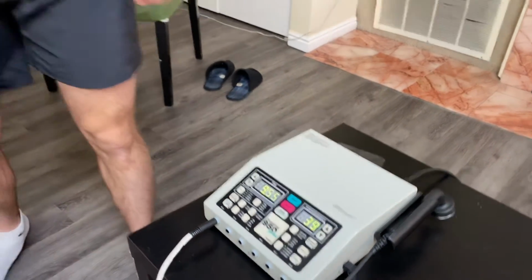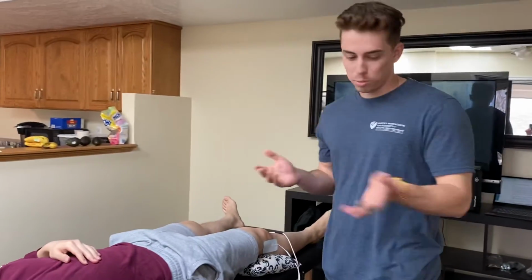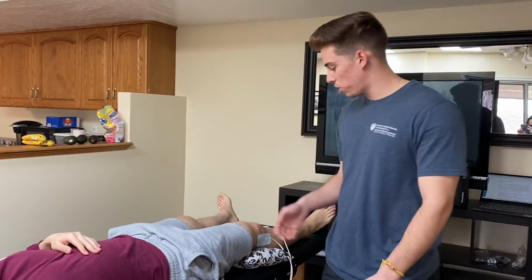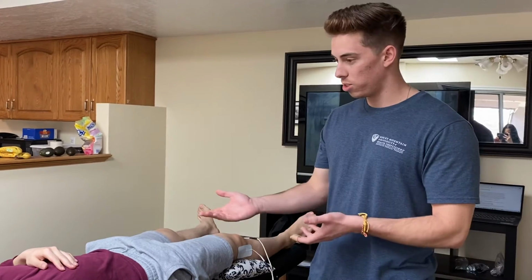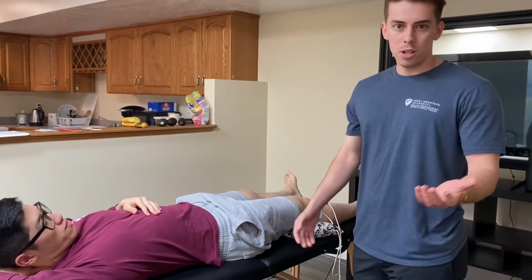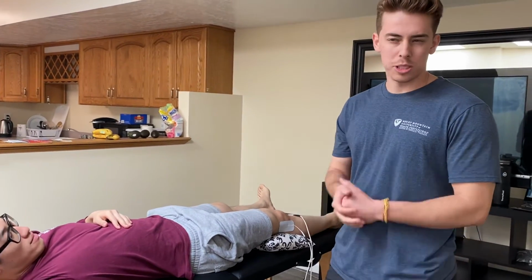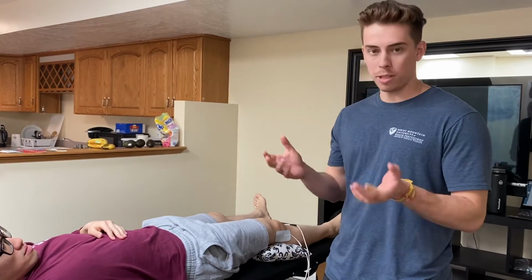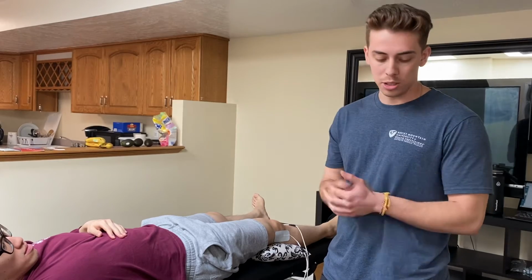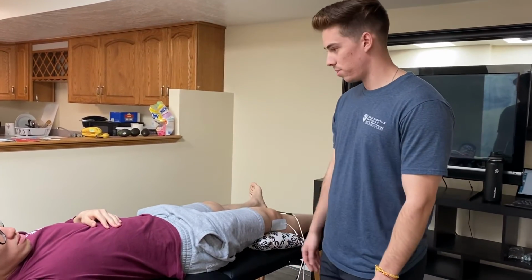Like I said, we usually put the patient on this the first time for maybe a half hour. For the purpose of this video, we're only going to do about 30 seconds. As we go through the treatment, we want to check in with our patient, making sure he feels okay. Are you uncomfortable at all, or does it feel all right? Just buzzing away. Great. Sometimes with electrical stimulation, in the first few minutes they might feel the intensity pretty well, but after that, they could get used to it. So it's good to check in and see if they want to raise the intensity at all. Are you doing good? Yep.